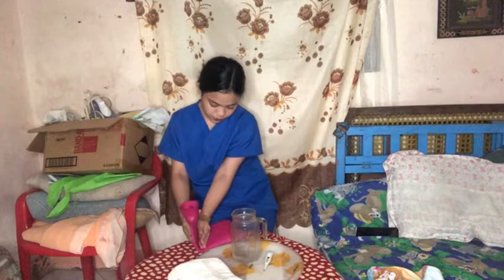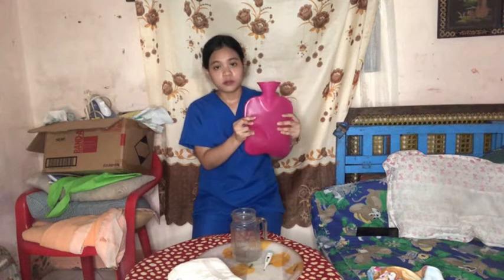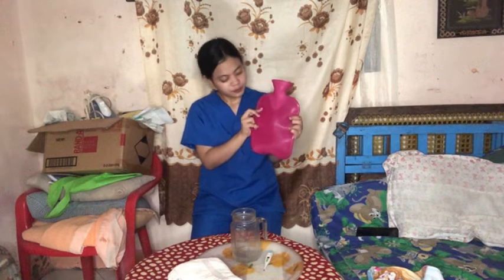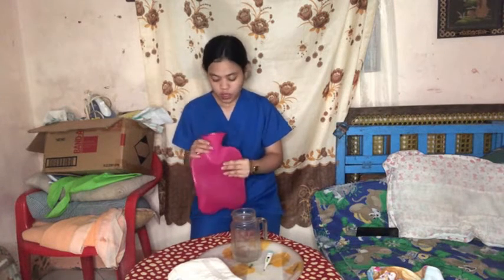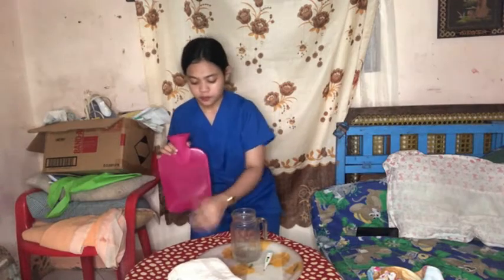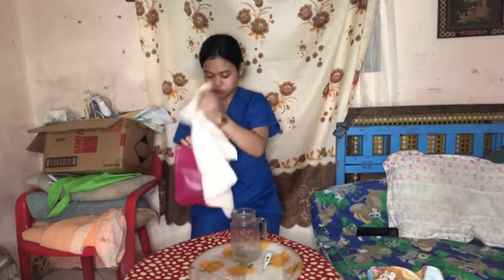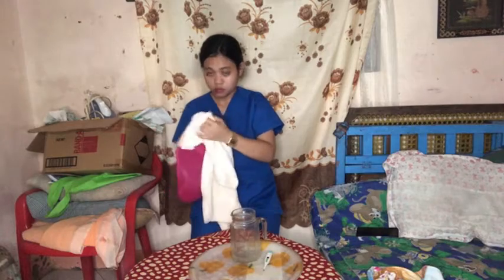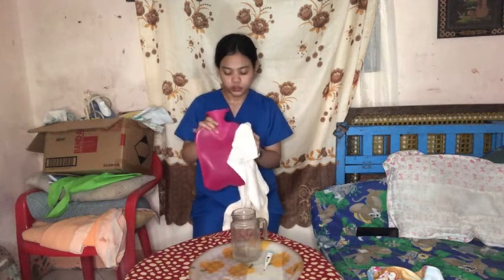As you can see, the hot water bag is flat. It means that there is no air. Then next, we need to dry the mouth of the hot water bag. Then also we need to dry the body parts of the hot water bag.